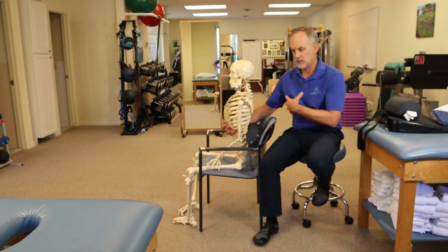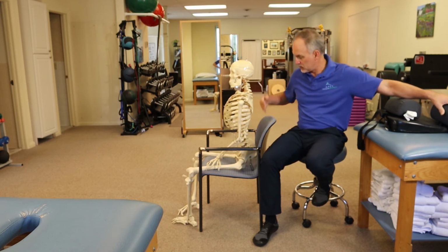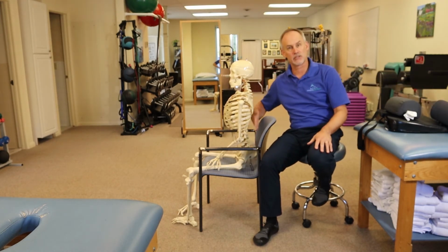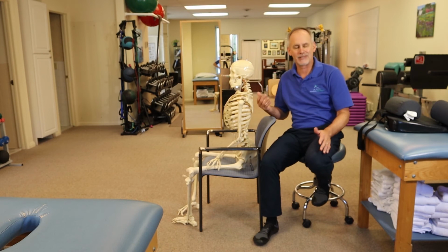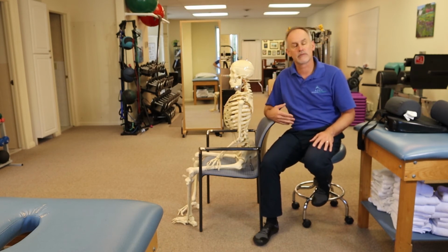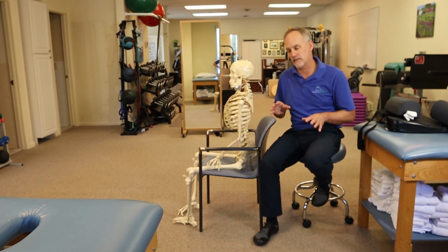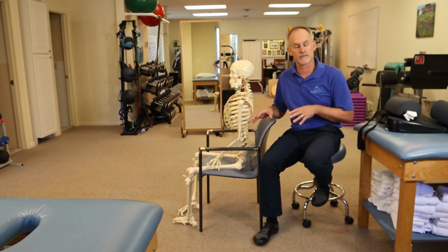And what we tend to do is flatten. I can't demonstrate with this skeleton, but basically we lose this curve and you'll see the back is a little straighter, okay? And that typically is not a friendly position for patients that are dealing with lower back pain. So that's something to consider when you're picking out your roll. But you've got to find the right roll for the right person.